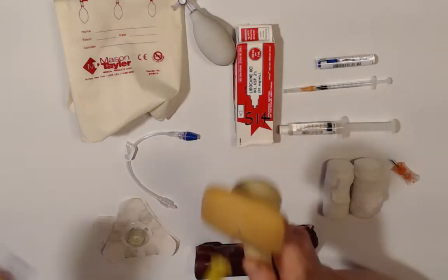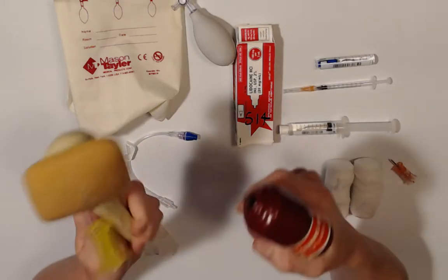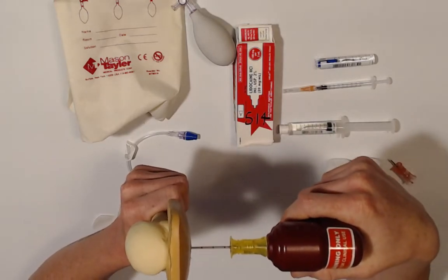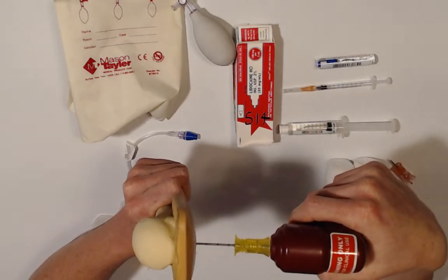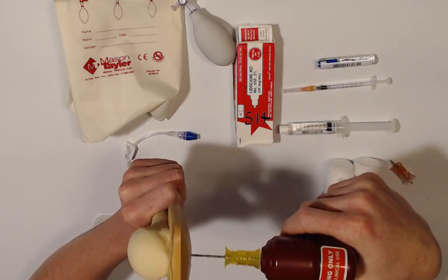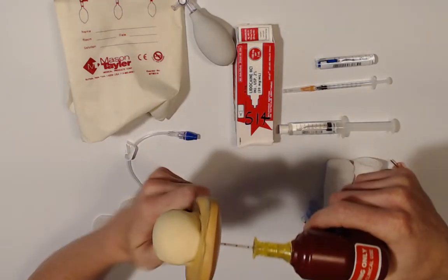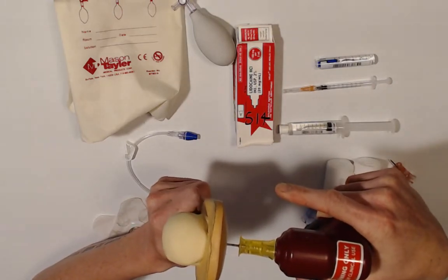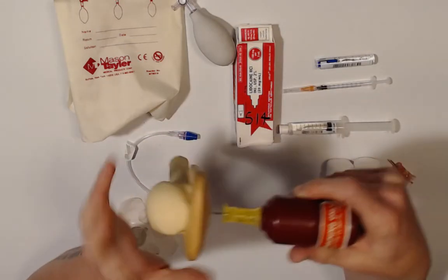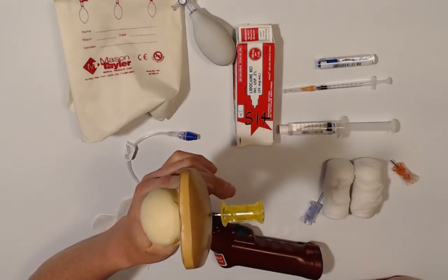So when we are drilling, it's all about feel and sound. You want to let the IO do the work. As we pull our trigger, you're just going to let it go, put a little bit of pressure on your IO, and you're waiting until you feel that pop or that give, or you can even hear sometimes the RPMs rev up. There you go. The IO is still going to stick out slightly, especially on the shoulders. That's okay. We're just going to have to really stabilize this site.